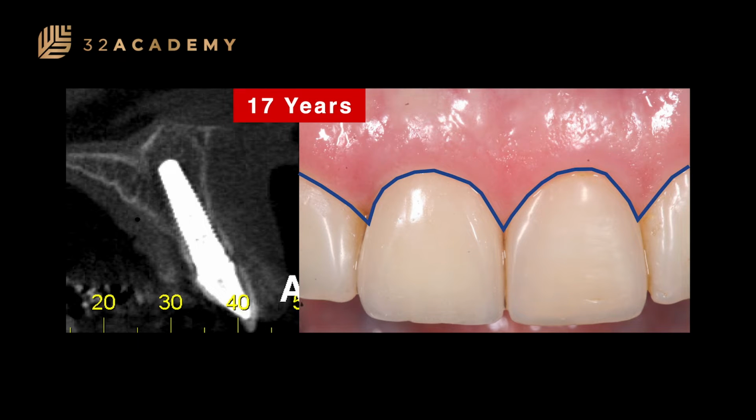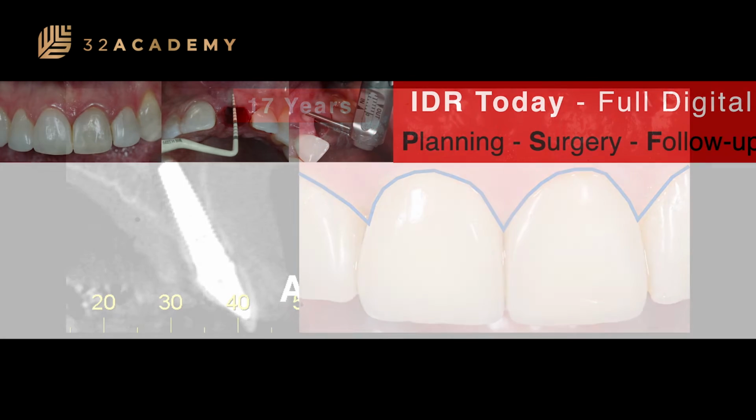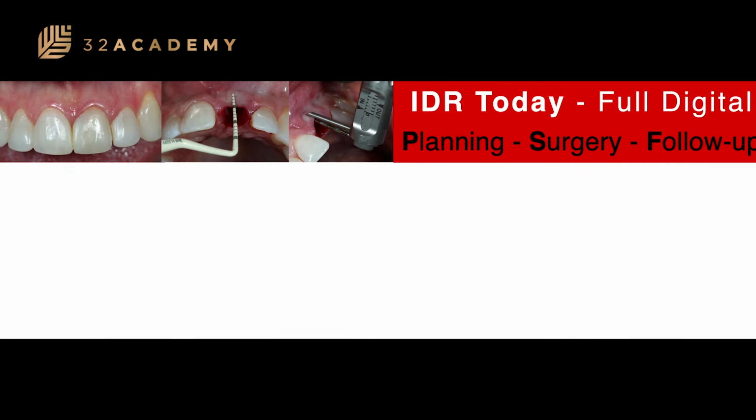No other technique available in the literature can allow you to get outcomes like this. IDR today is fully digital from planning, surgery, and the follow-up. Look at this case. The hopeless tooth was the upper left central incisor. It was missing the buccal wall, and this patient had a thin periodontal biotype.